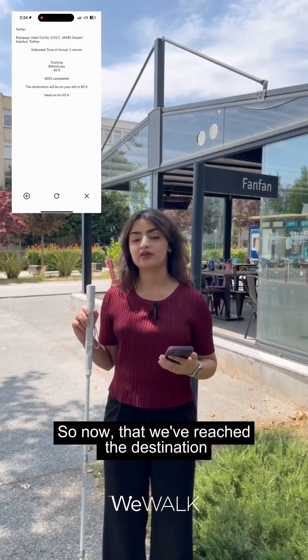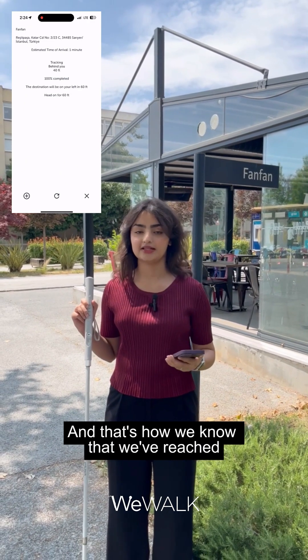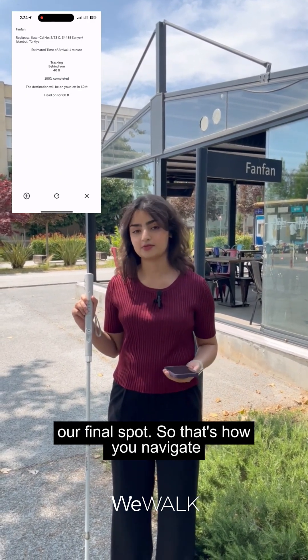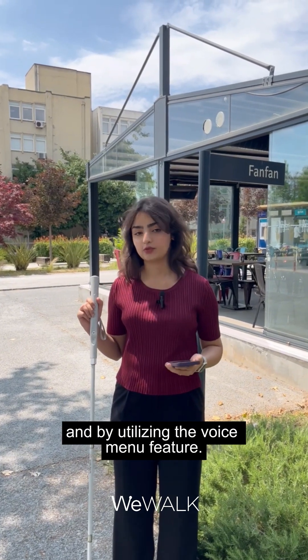Now that we've reached the destination, the navigation is 100% complete and that's how we know we've reached our final spot. So that's how you navigate using the WeWalk SmartCane 2 by utilizing the voice menu feature.